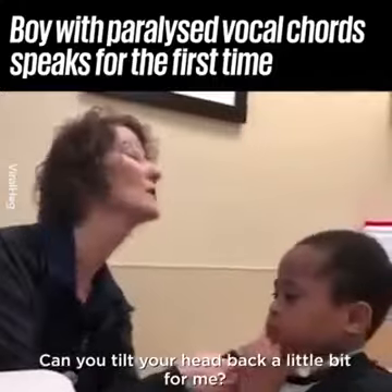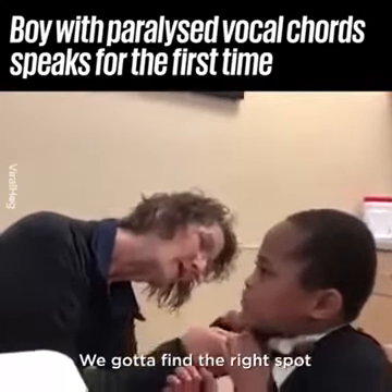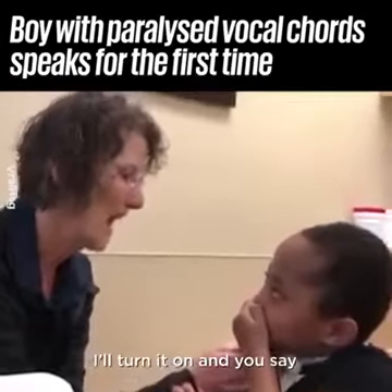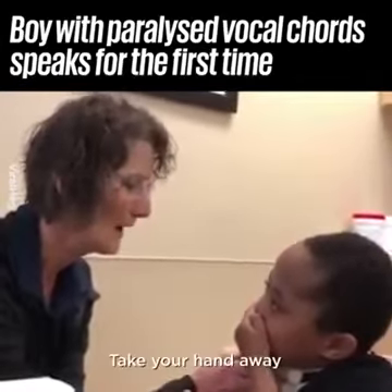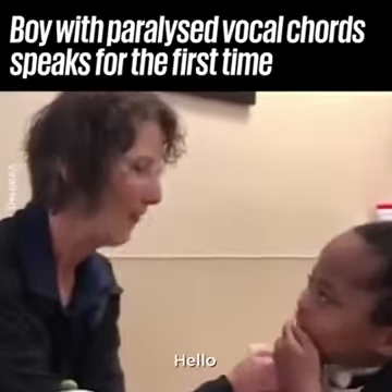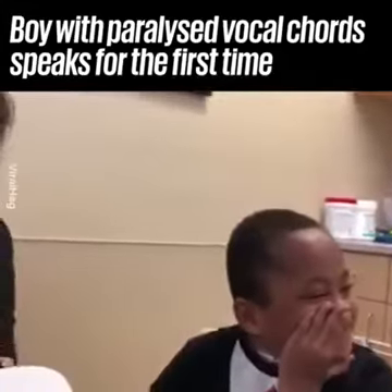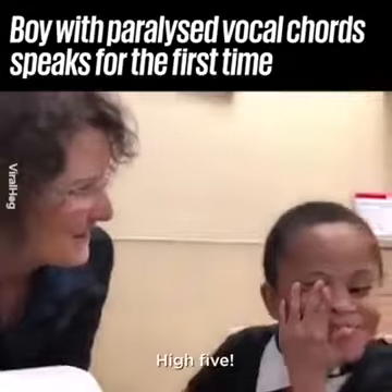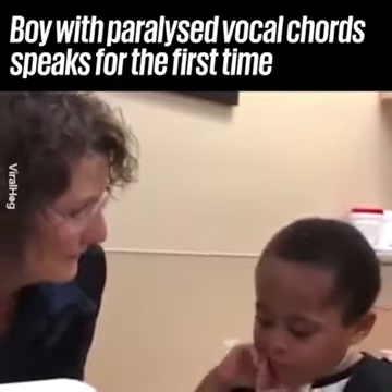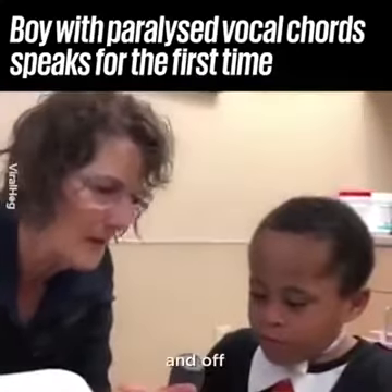Let me see where your chin is. Can you tilt your head back a little bit for me? You gotta find the right spot. Okay, are you ready? I'll turn it on and you say hello. Is that cool? Can you try again? Here's the button — on and off.